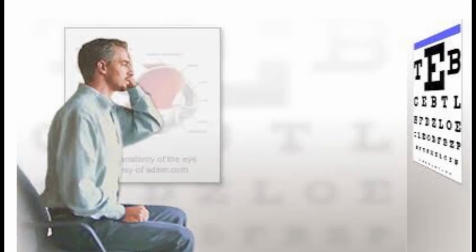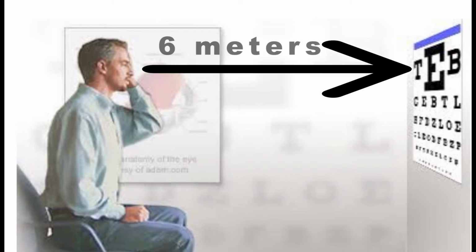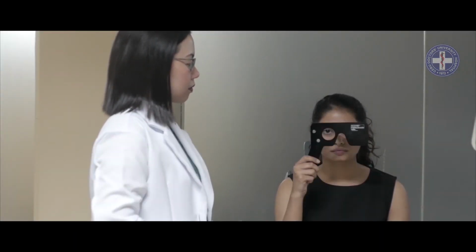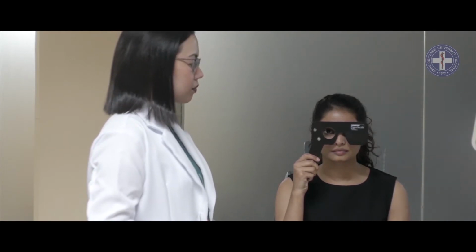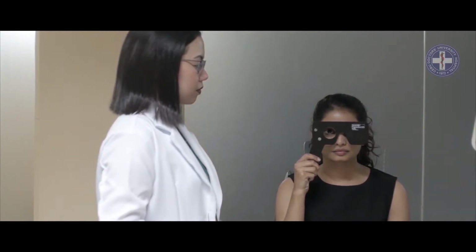Distance visual acuity begins with the patient sitting 6 meters or 20 feet from a Snellen's chart. Test one eye at a time. Occlude the other eye without pressing on the globe. Let's start with the right eye. Ask the patient to read, without squinting, from the biggest letter down to the smallest line on which he or she can correctly identify letters.